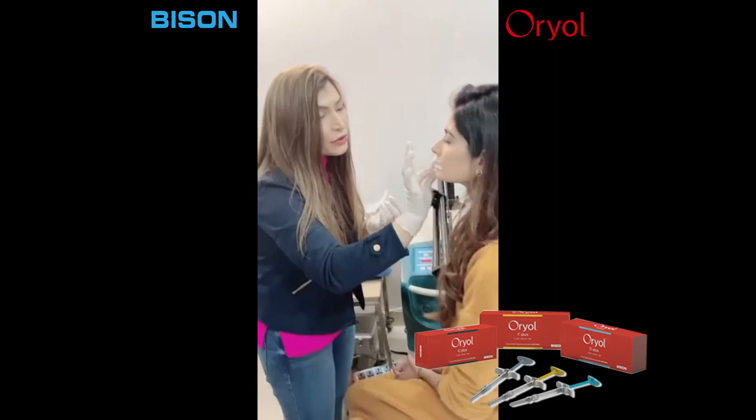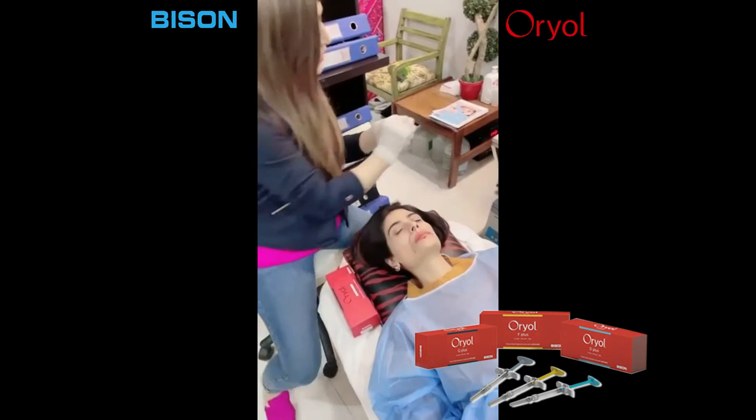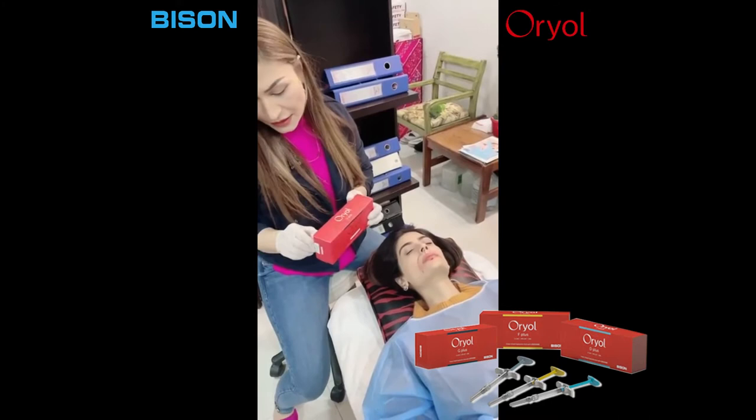I'm not going to give her a local injection. I'm just using an applicator as well, for antiseptic conditions. I'm going to use Oriole G+.